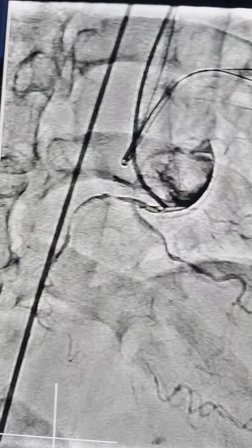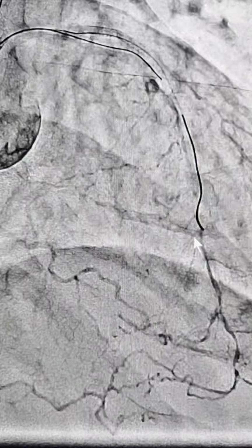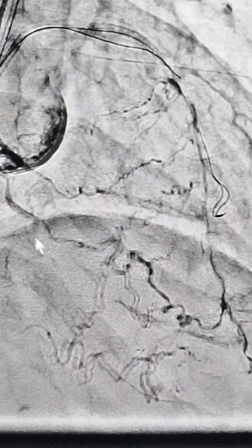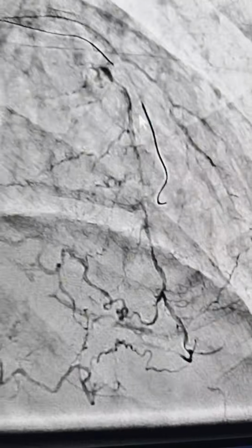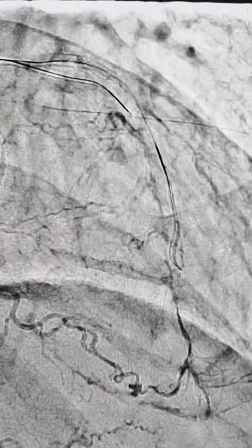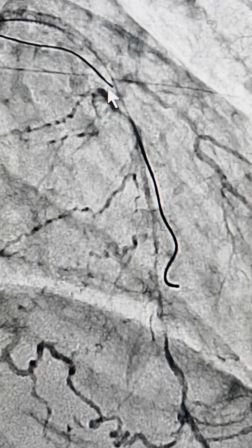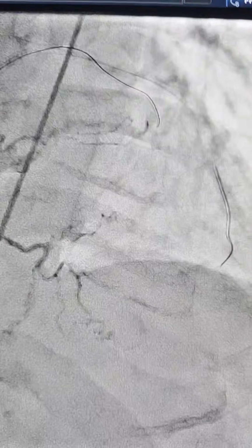So this is filling through this non-dominant vessel, and you can see the whole LAD filling through this RV branch here. This RV branch fills the whole of the LAD, which is diffusely diseased. In the middle it goes up, and my wire is in the mid part of this junction where there's a 90-degree turn here.